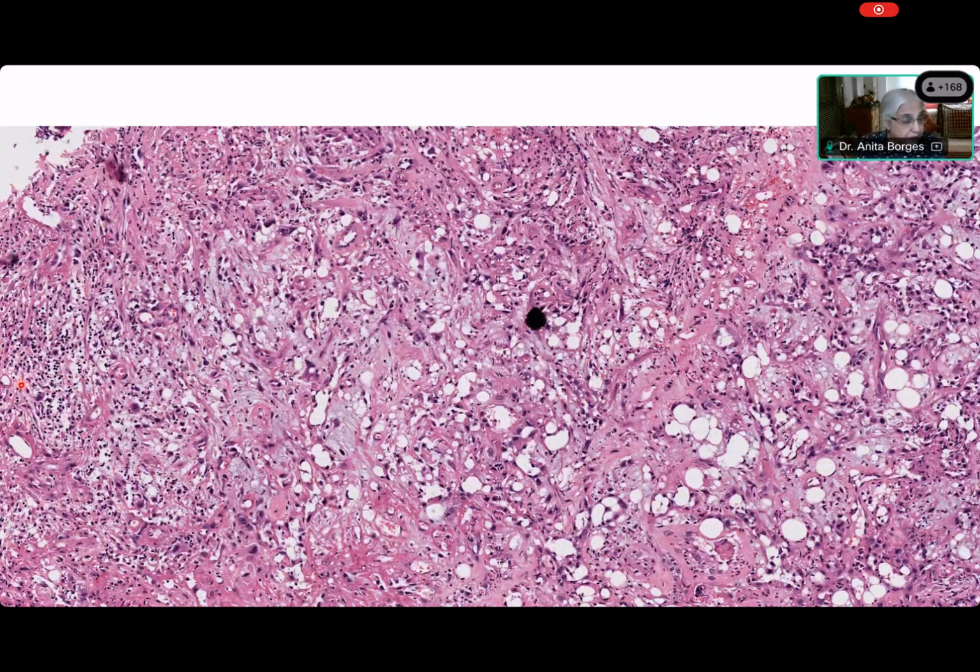Is Deepak back or has Deepak disappeared? Deepak, are you there? Yes, ma'am. Right. Are you going to call this an undifferentiated tumor? Sorry, a poorly differentiated tumor? Deepak, just say yes or no. Yes, ma'am. Don't go off the air. Can you see any differentiation in this tumor? And if you do, tell me what kind of differentiation you see.